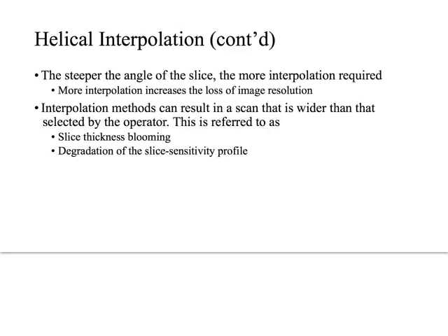The steeper the angle of the slice, the more interpolation will be required. And when we talk about the steepness of that angle, what we're really talking about is pitch. It's also on page 52 and page 53. In terms of understanding helical scanning and everything, these two pages are solid gold.